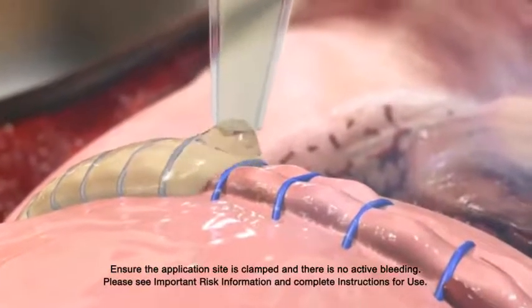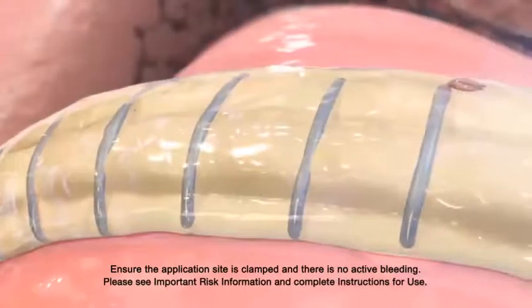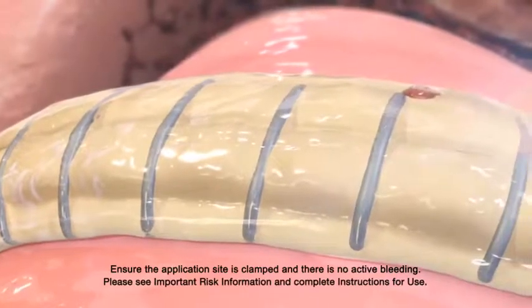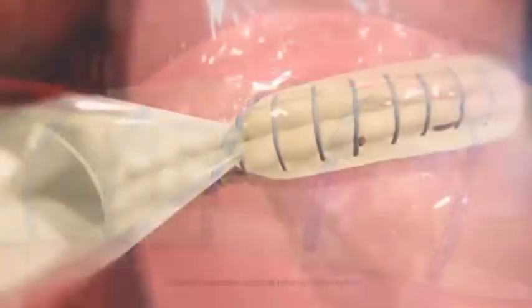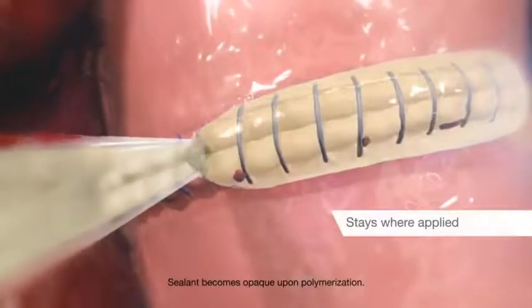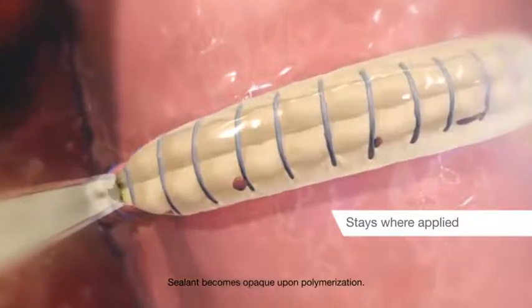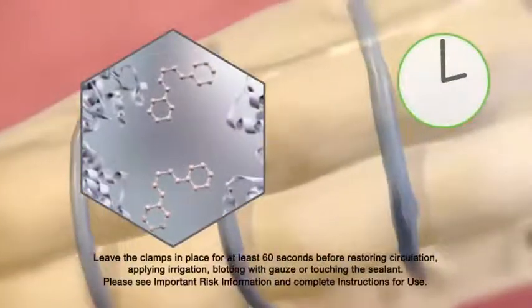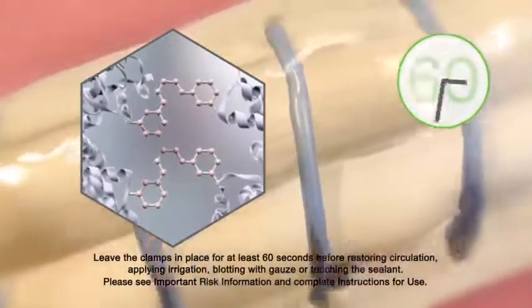Once applied, the sealant rapidly cross-links with tissue or graft material to form a strong and stable bond. The natural golden tint allows for precise placement while keeping suture lines visible. The sealant will stay where it is applied and won't leak through suture holes. Upon application, Previleak gels in 10 to 15 seconds with a seal achieved in 60 seconds.